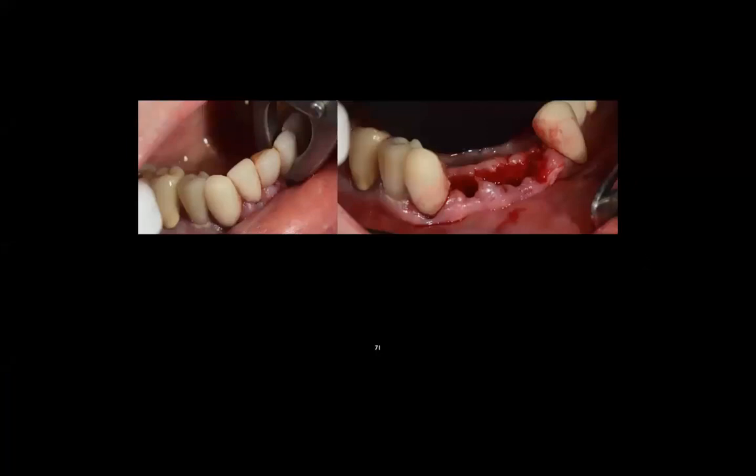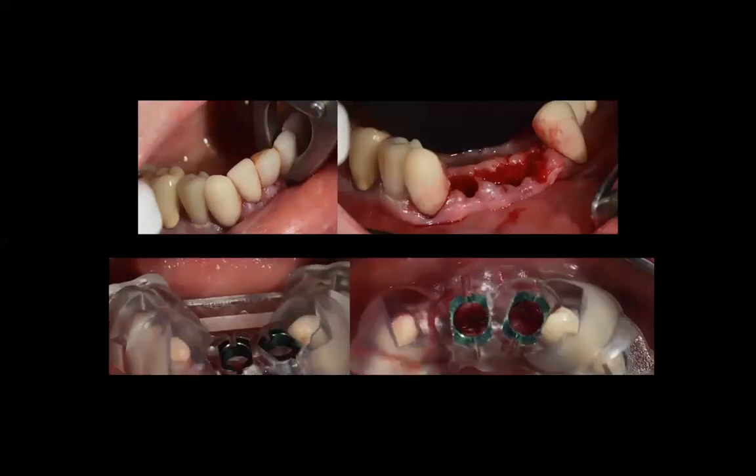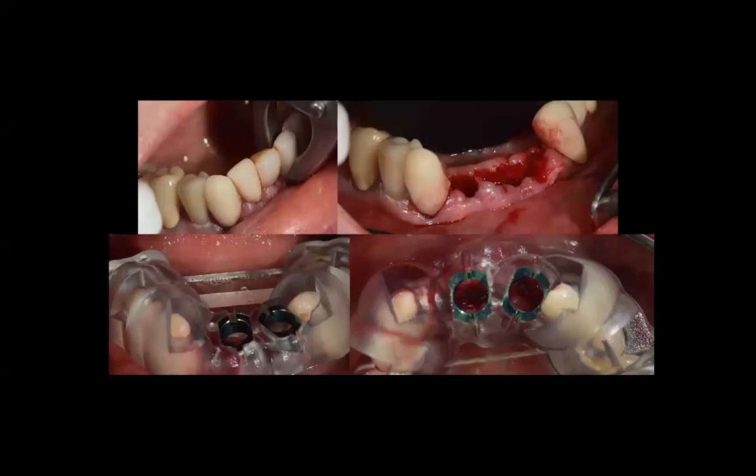So a patient comes in, we extract the tooth, we clean up the area, we place the guide. Now, most companies, or when I make my own guide, create these windows. Take a look at these windows. You see these windows where there's nothing there. There's another one here, there's another one here. These windows are basically to verify that the guide is sitting in a correct position.